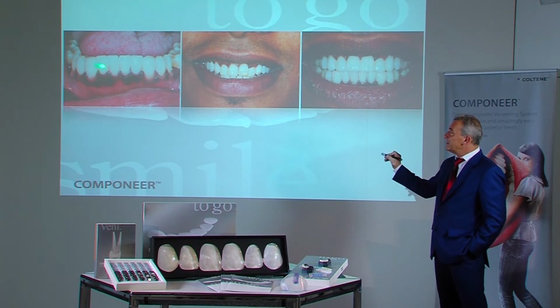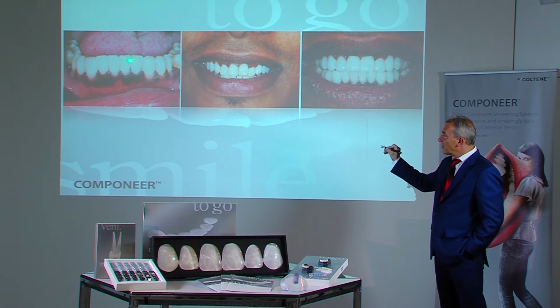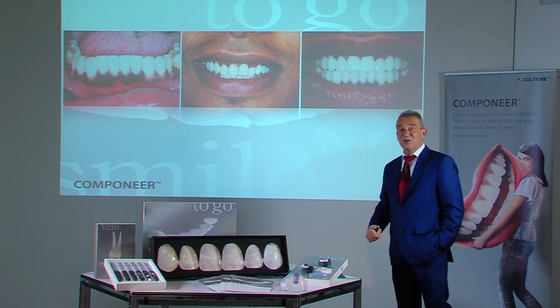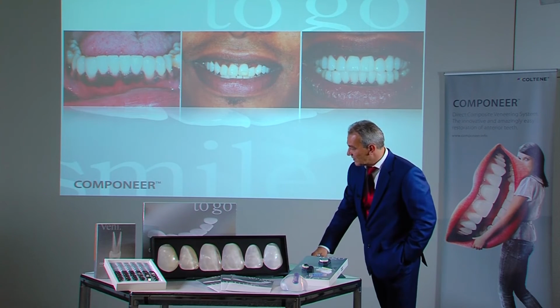Here we can see the componeers aligned in a row in the mandible. One can also see the nice cervical finish, which means the rubber dam was in the right position. Due to the strong contrast with the gingiva, the situation looks relatively bright again.